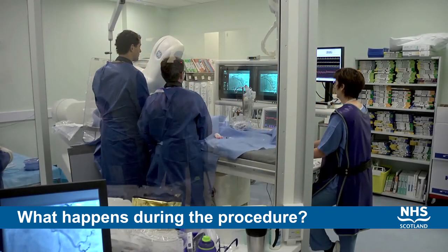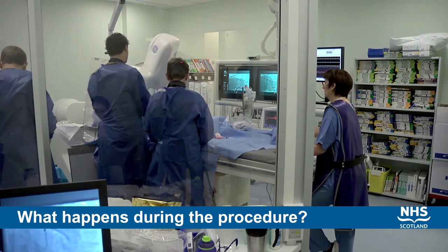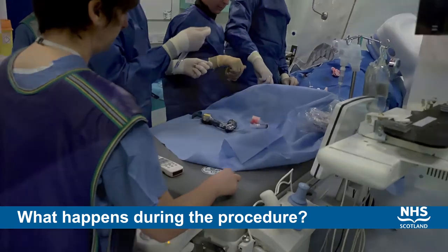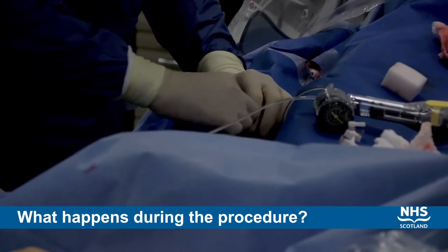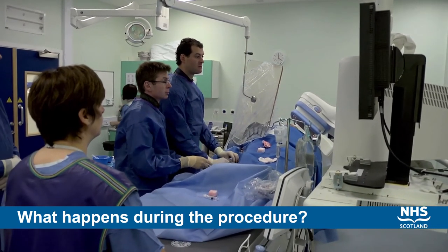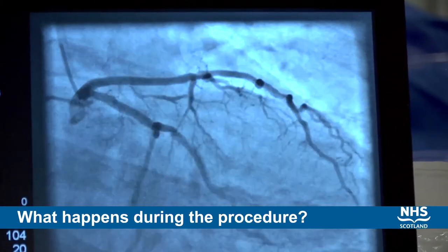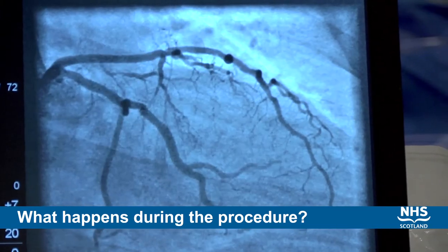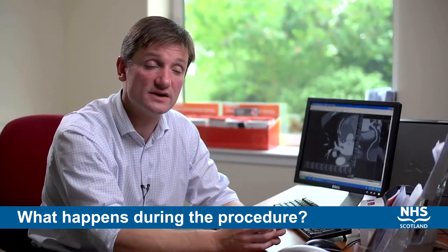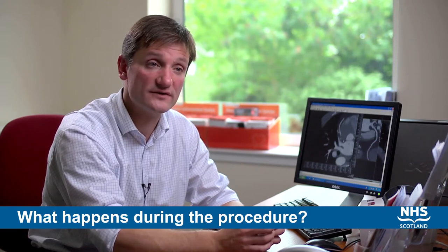We have the option during the procedure of investigating the narrowings more closely using a pressure wire. This may involve passing a very fine guide wire across the coronary artery narrowing and administering a test drug called adenosine, which will result in a degree of flushing or chest tightness that is very short-lived and only lasts a few minutes. This test allows us to further assess the severity of coronary narrowings and whether they need treatment.